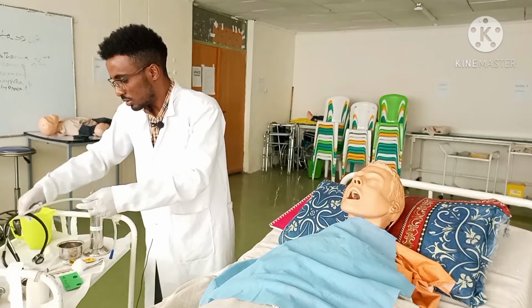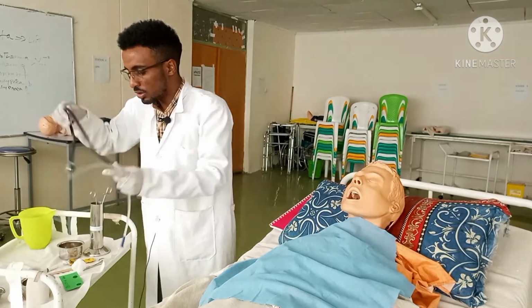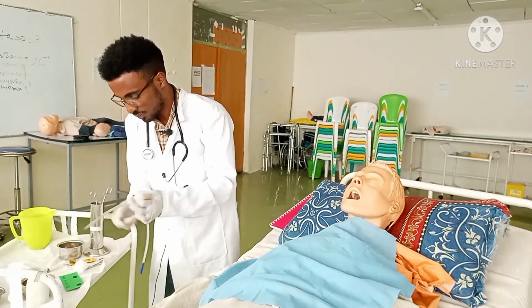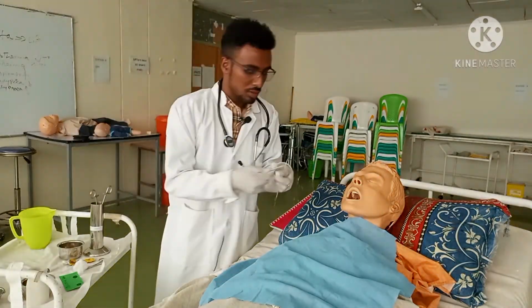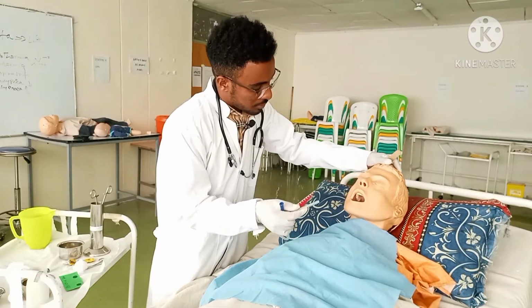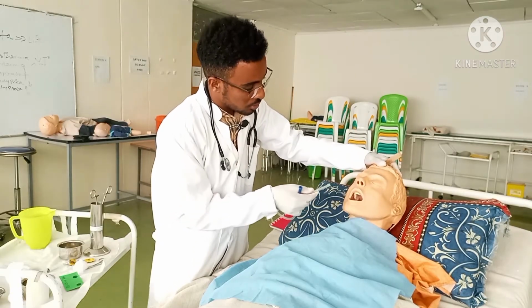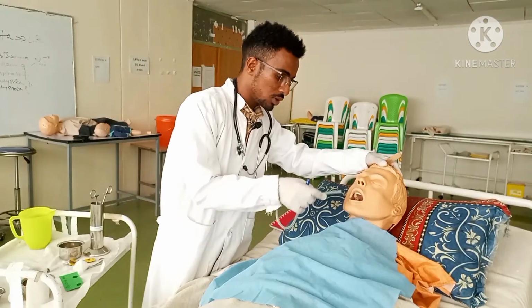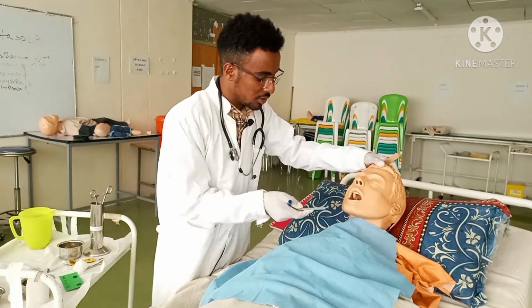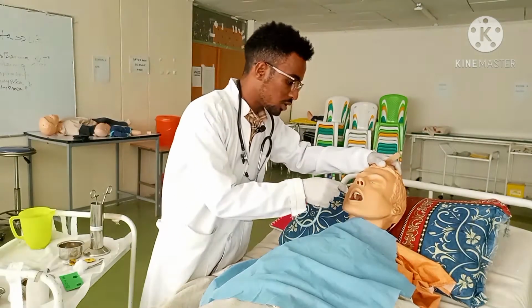Then you have to prepare your stethoscope and also hold your nasogastric tube. Mr. John, I am going to insert a tube so your nostril may have some discomfort. While I am inserting, you have to swallow to facilitate insertion. If you feel any discomfort, do not hesitate, report to me.